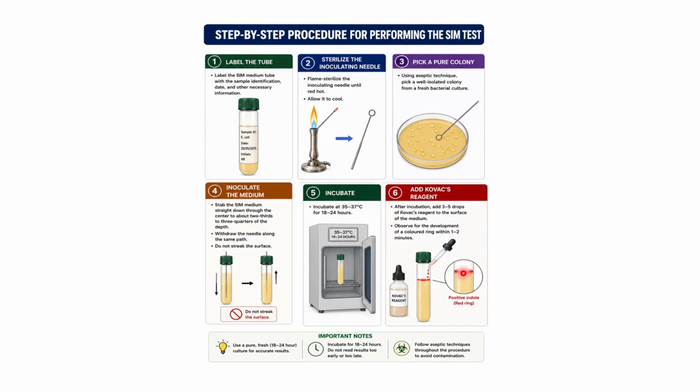So some important notes. The first is to use a pure and fresh, which is 18 to 24 hour, culture for accurate results. Incubate for 18 to 24 hours, and do not read the result too early or too late. And always follow aseptic techniques throughout the procedure to avoid contamination.